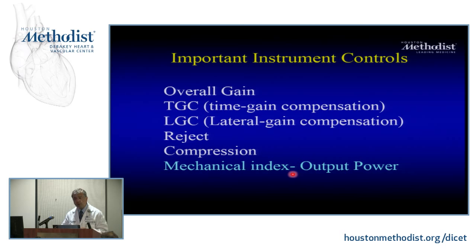And that power is very important because you think of ultrasound being benign. Right, it is benign because it's regulated. The machines are not allowed to go beyond a certain output. If it does go beyond a certain output, you can still have ultrasound that can break gallstones, that can fry certain tissues. So, I mean, you can emit as much energy as you want. And I think this is safety not only for the adult, but also for the fetus, because you use this also in fetal ultrasound. Okay? So the output power is important.